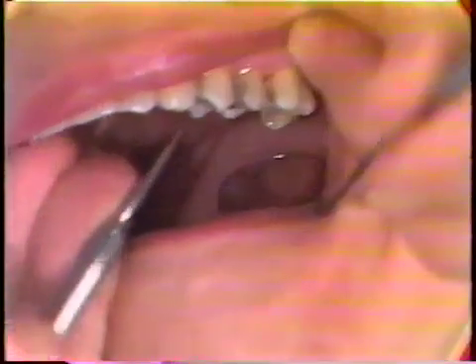Occasionally, when you remove dressing material from in between the teeth — as we had to between the molars — there will be a little hemorrhaging, as is now going on between the two molars, but this is something that doesn't last long. The next procedure is to apply xylocaine over the area. This 4% liquid xylocaine is being applied while the cotton ball is used to wipe off loose, soft debris from the teeth and from the gingival tissues, to debride the area and clean it up.